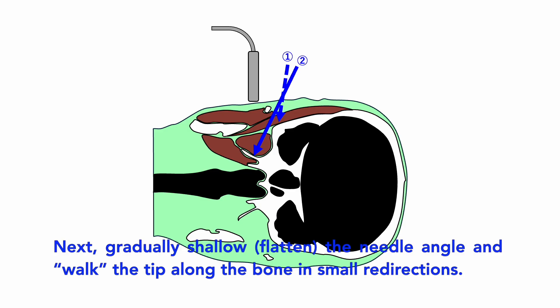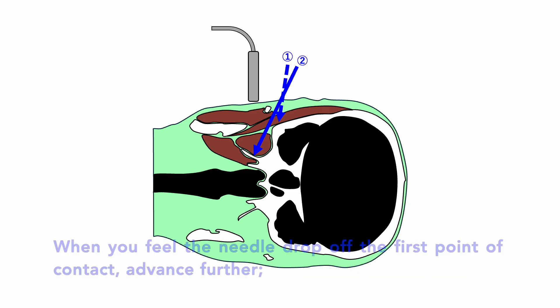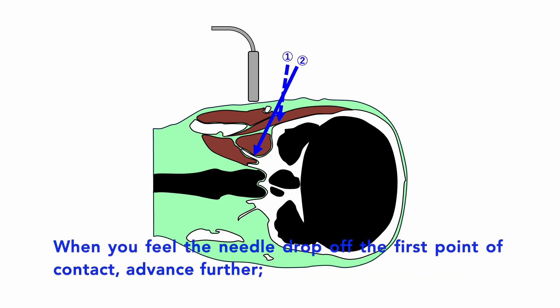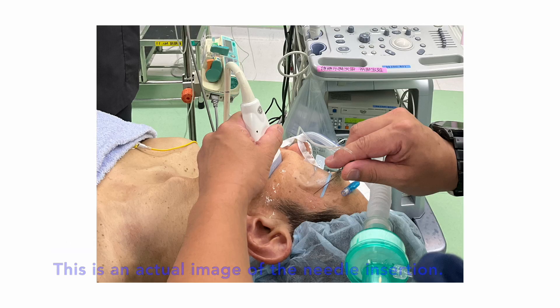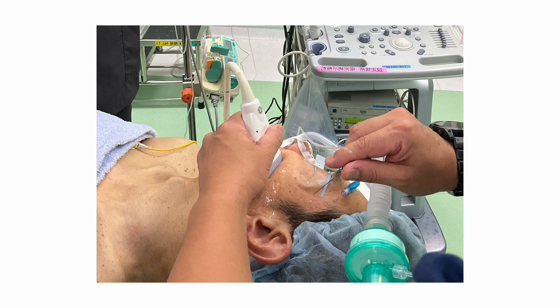Next, gradually shallow the needle angle and walk the tip along the bone in small redirections. When you feel the needle drop off the first point of contact, advance further. At a depth of about four to five centimeters, you will contact the lateral pterygoid plate. This is an actual image of the needle insertion — the needle is inserted along the extended line of the palpebral fissure.